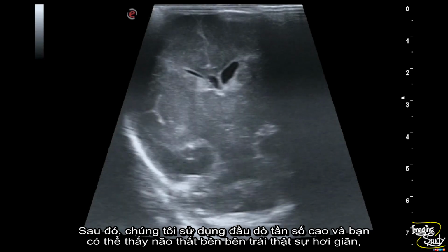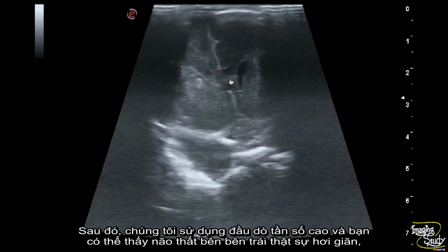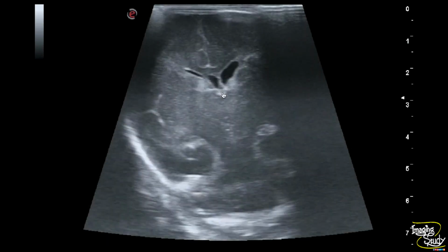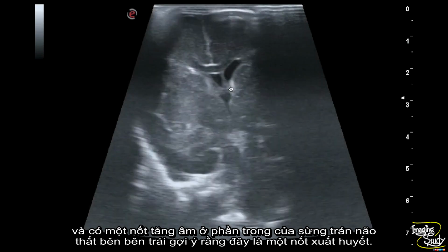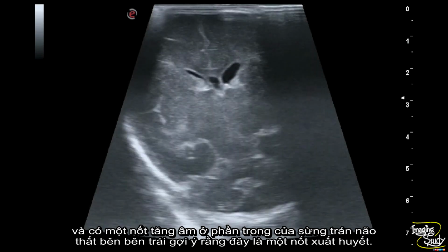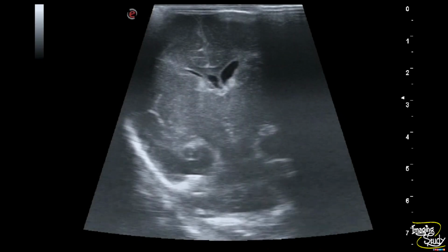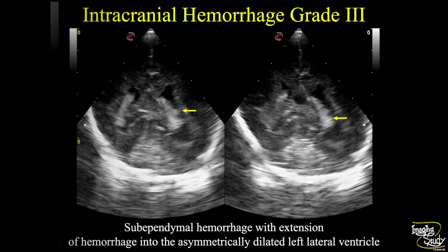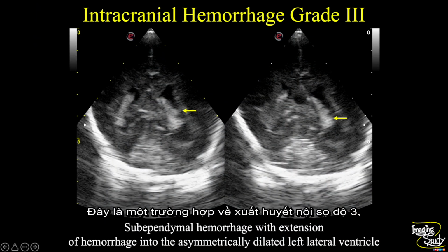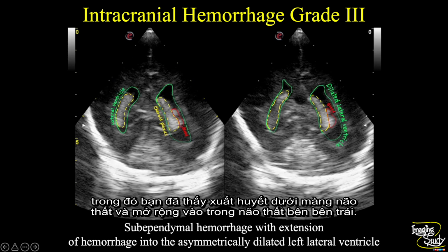We have done a high frequency ultrasound here, and you can see the left lateral ventricle is slightly dilated. There is an echogenic focus at the medial aspect of the frontal horn of the left lateral ventricle, indicating a focus of hemorrhage. So this is a case of grade 3 intracranial hemorrhage where you have seen subependymal hemorrhage with extension of hemorrhage into the asymmetrically dilated left lateral ventricle.